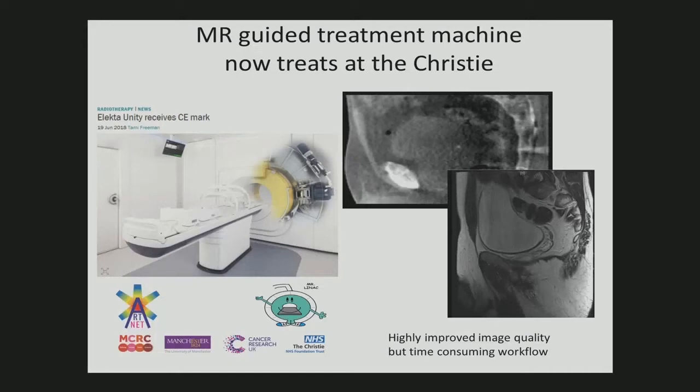Now, a linear accelerator is an acceleration tube. It's incredibly sensitive to magnetic fields. And an MR has strong magnetic fields. Basically, they're fundamentally incompatible. So there was a lot of work to make the shielding, active shielding, to make these things work together. So this is the MR coil, magnetic resonance imaging.